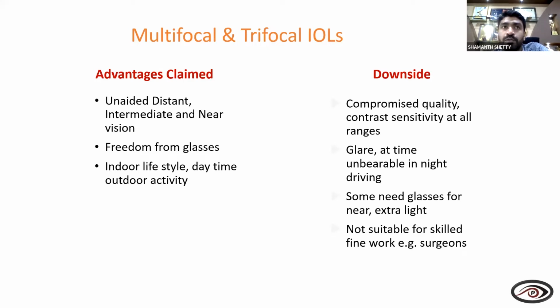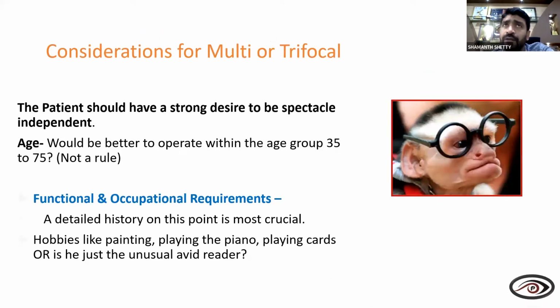For people with a very active nightlife, like driving, going out, socializing, partying, this glare can become unbearable and they cannot live with it. This set of patients is going to comprise a large proportion of our cataract surgical patients in the future, and they needed some kind of an option.